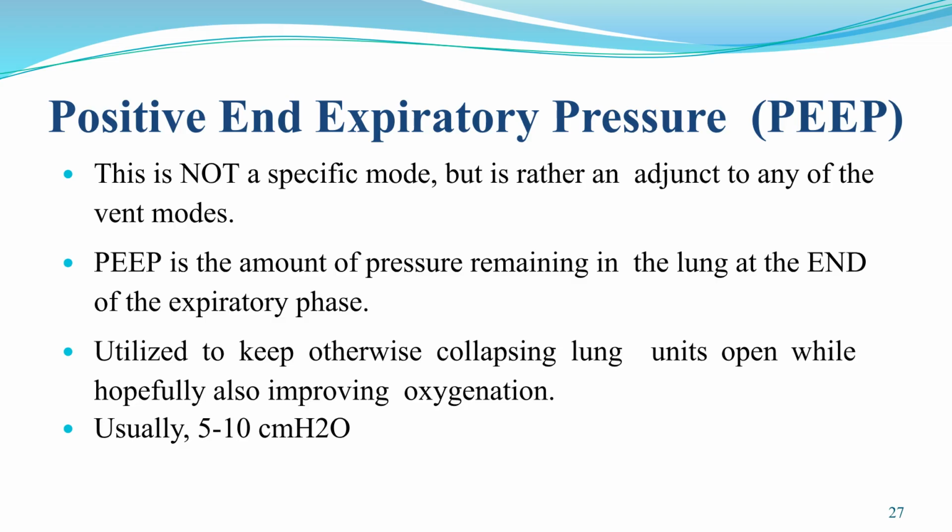Positive end expiratory pressure, or PEEP, is an adjunct to vent modes. It is the pressure remaining in the lung at the end of the expiratory phase, used to keep collapsing lung units open and improve oxygenation, usually set at 5 to 10 cmH2O.